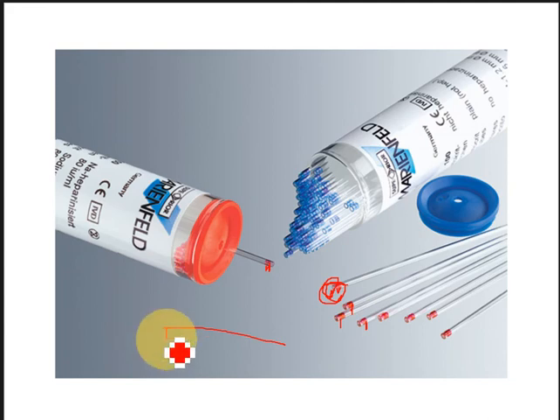So usually guys, the microhematocrit tube has a band. So this is where you collect the blood, and then it has one end here without a band. So here you seal using the sealants. Okay? So I hope that's clear.